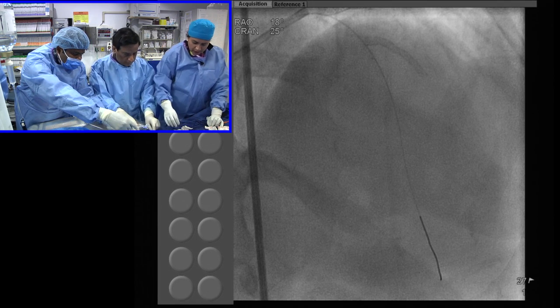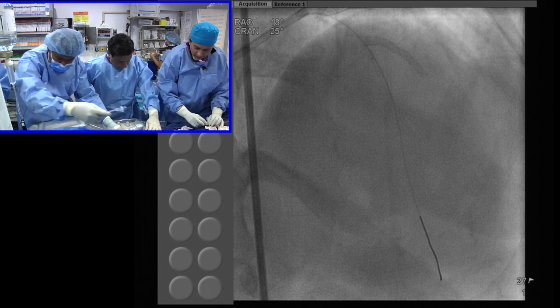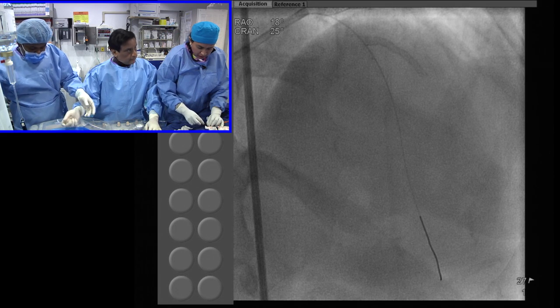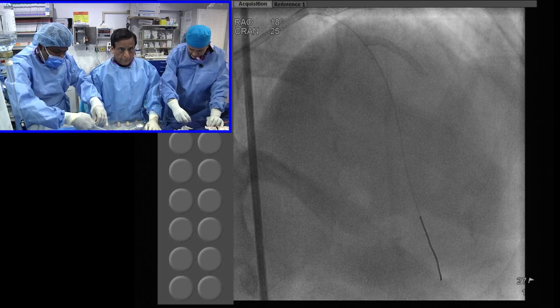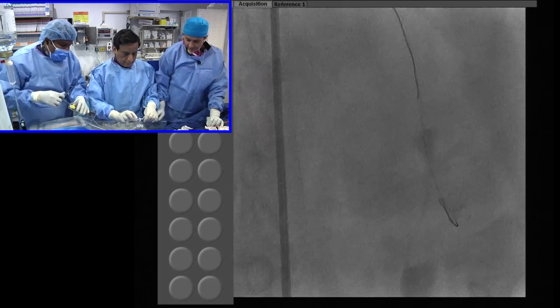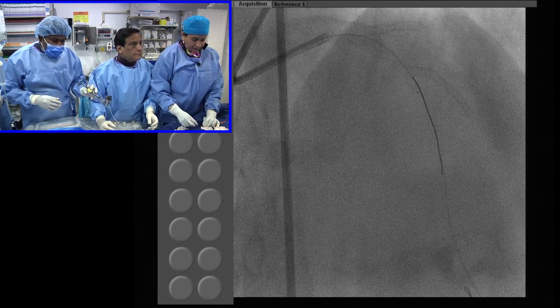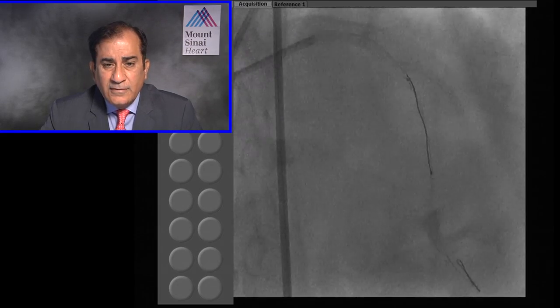We are doing techniques that we do not usually do. Normally you do a distal stent and then a proximal stent. To avoid overlap, we did it this way. So there are a lot of things that are changing. We just have to be careful. I think this is precisely where these cases would be so instructional, for fine tuning some of the techniques we've been using with the standard techniques.